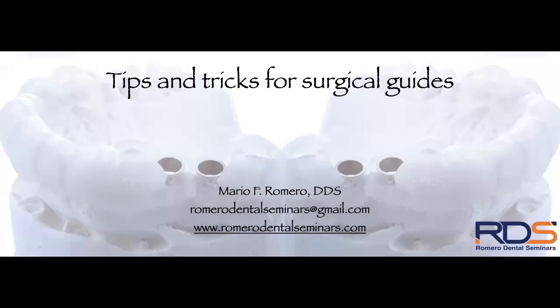Okay, so today we're going to talk about tips and tricks for surgical guides.